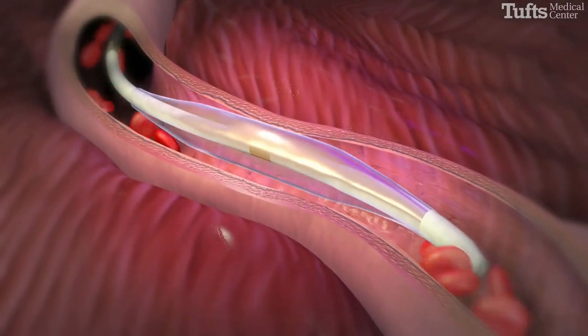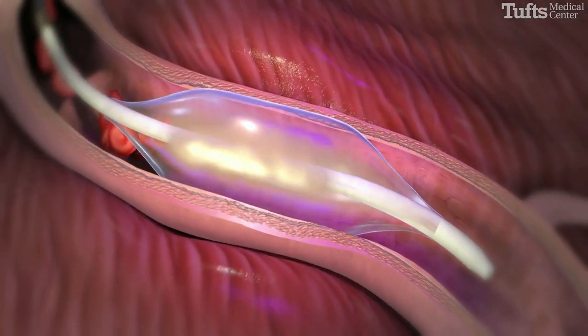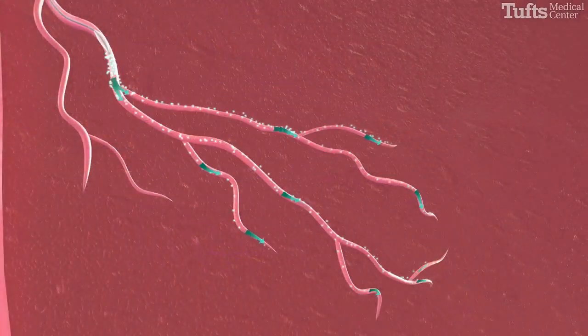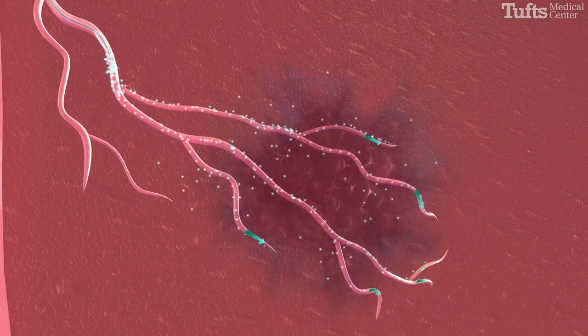a tiny balloon at the tip of the catheter is inflated, blocking blood flow. One to two cc's of absolute alcohol is then injected through the catheter and into the septal artery.